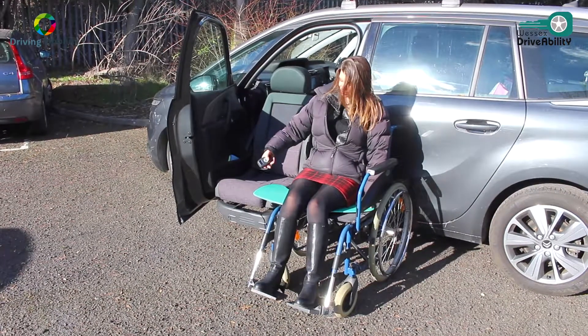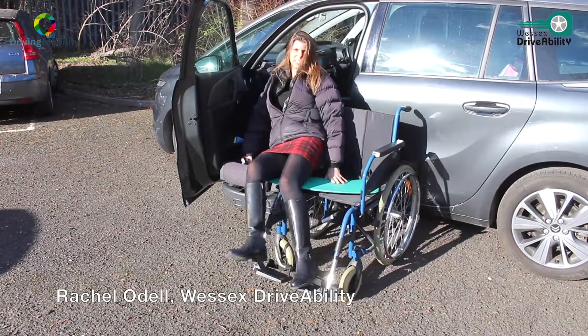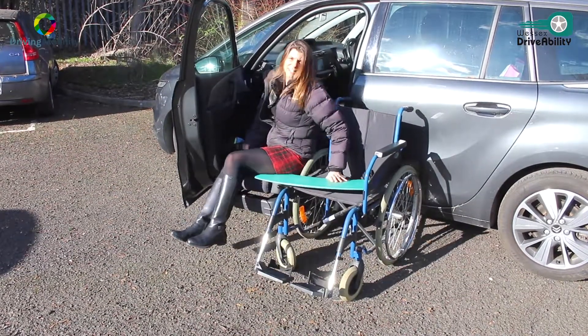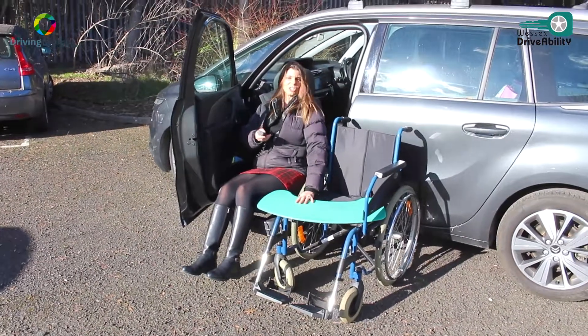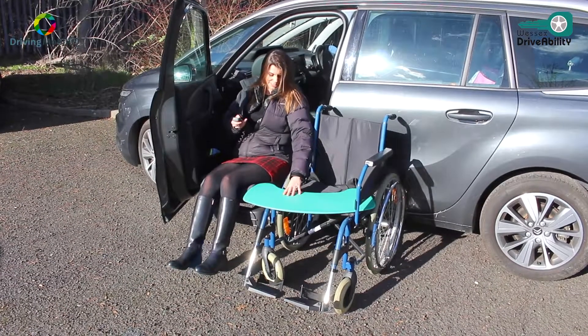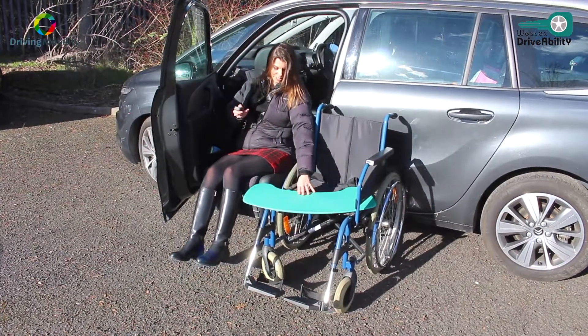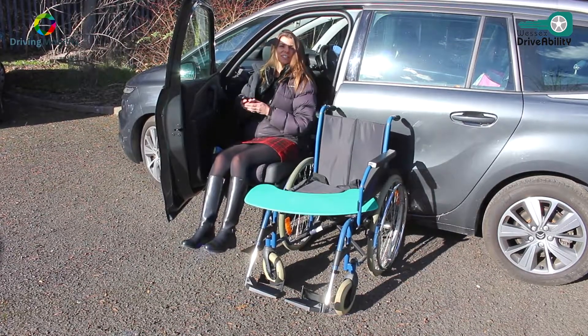I'm just using the transfer board to slide onto our electric turning front seat. Sliding across, and if the seat is automated, just use the buttons to move it up and down. Backwards into the door, making sure the board is out of the way, and then everything else is done on the buttons.